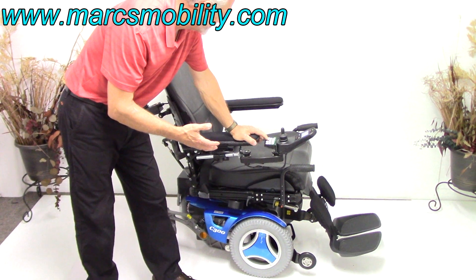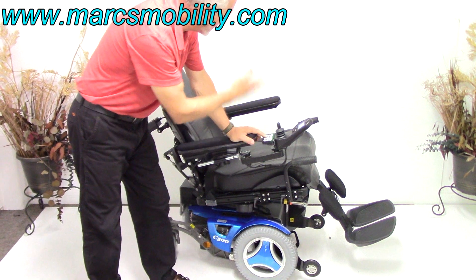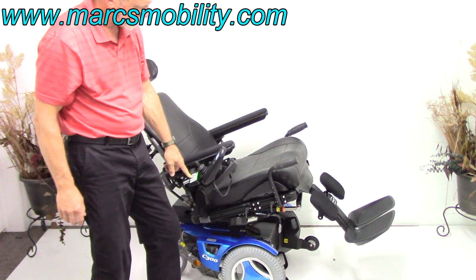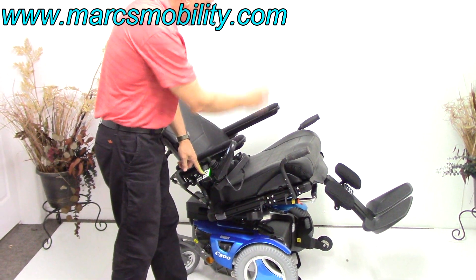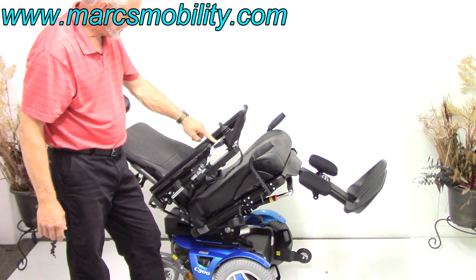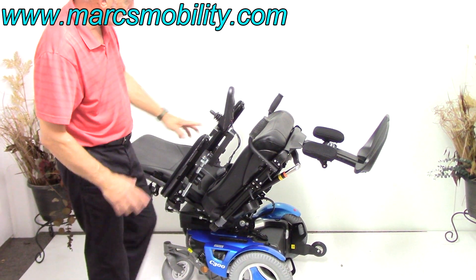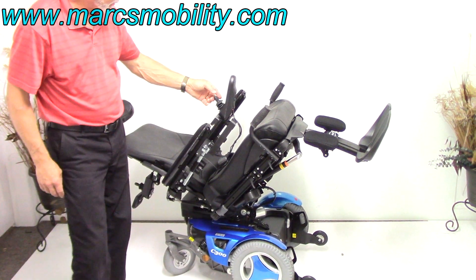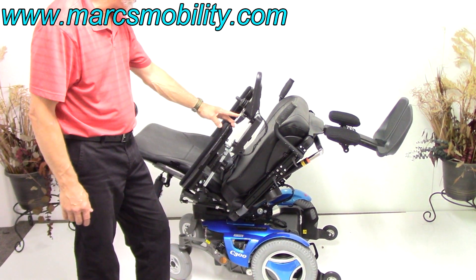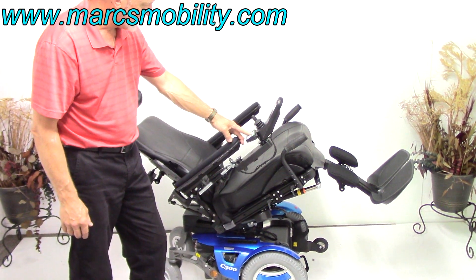The next option is the electric tilt. This is the electric tilt going back — the bottom tilts back and you see the whole seat tilts. There's also a swing-away joystick on here, so the joystick can swing out of the way. We can put it on the left or on the right with no problem. This chair actually drives with the seat tilted — it does move, though I don't know if anybody would want to drive like that.